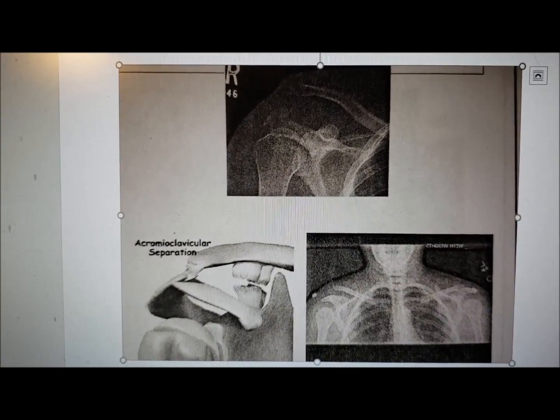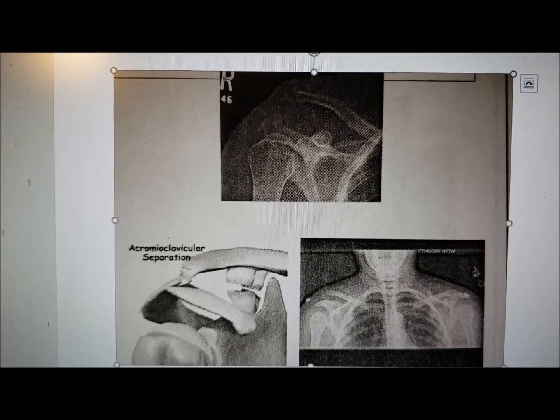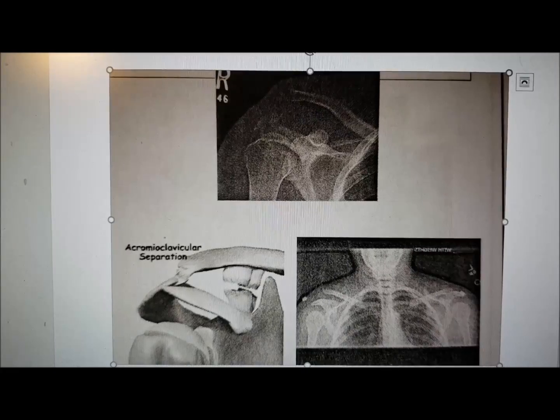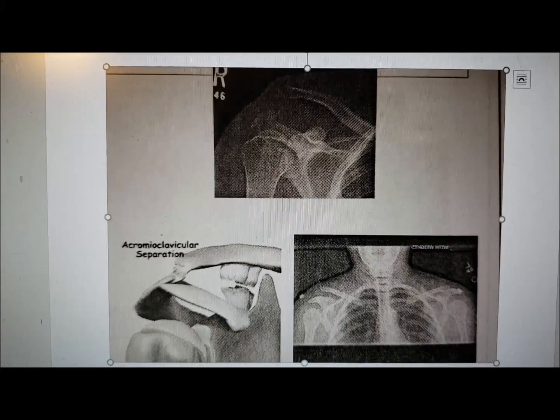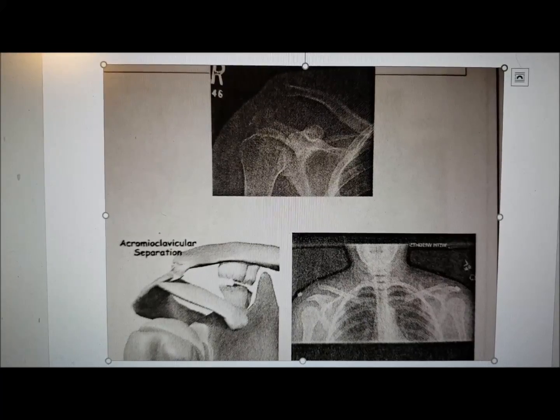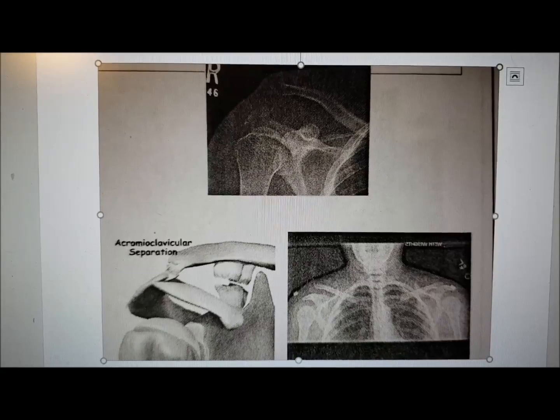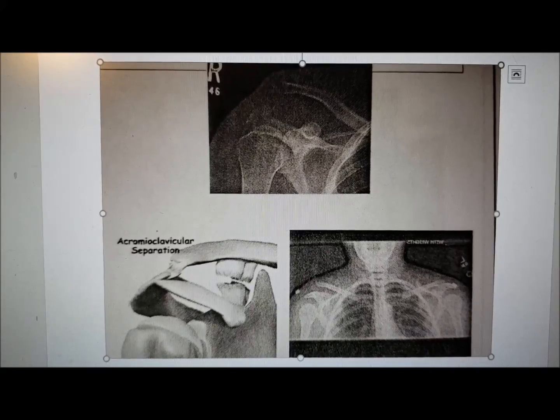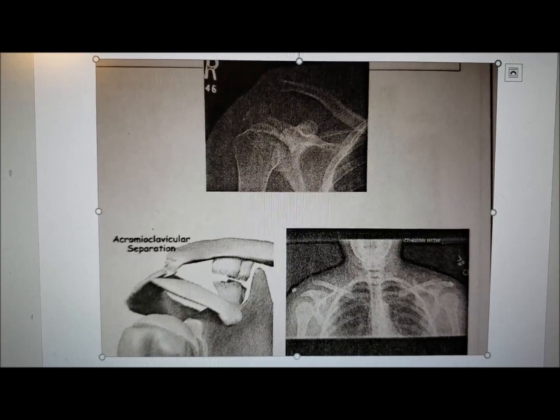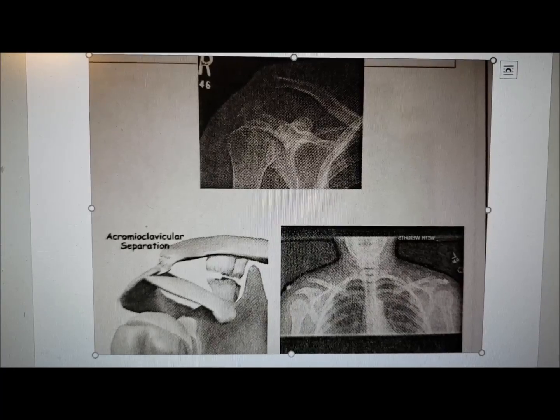Clinical indications would basically be a person coming in with pain in their shoulder or upper back near the scapular region. A few different pathologies seen on x-rays would be the acromioclavicular joint dislocation, where the distal clavicle would be displaced superiorly, best seen on a bilateral erect AC joint x-ray.